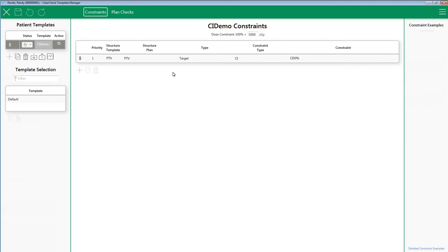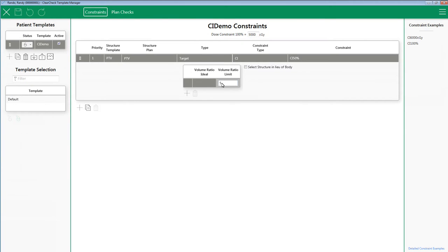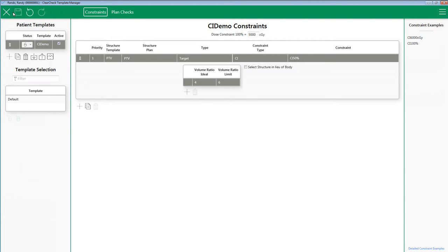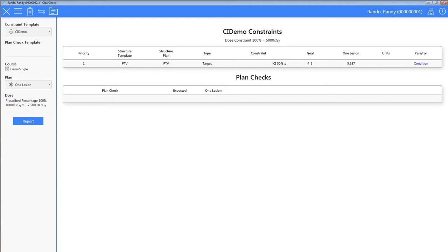If you want to set up a condition range, which might be considered the same as minor deviation in RTOG protocols, you can add an ideal ratio. For this example, I am going to keep my limit at 6 and put an ideal ratio of 4. Run ClearCheck, and now you can see that it conditions because my result is in between the ratio ideal and the ratio limit.